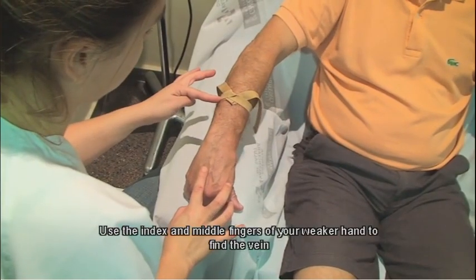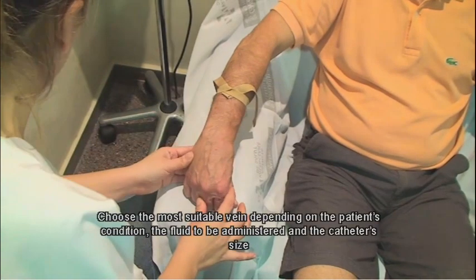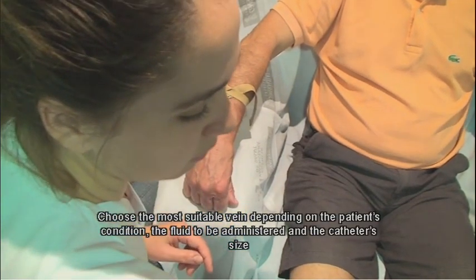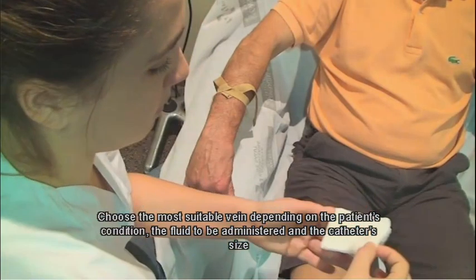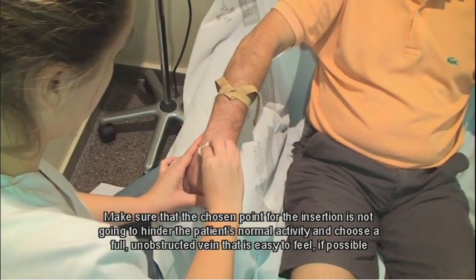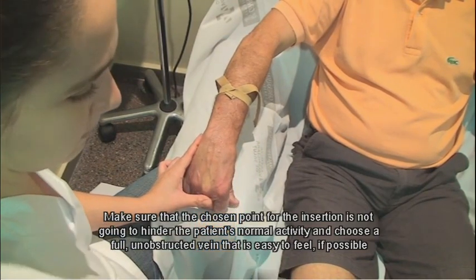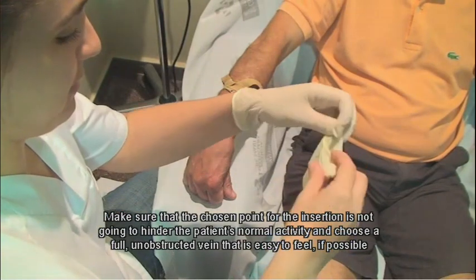Use the index and middle fingers of your weaker hand to find the vein. Choose the most suitable vein depending on the patient's condition, the fluid to be administered, and the catheter's size. Make sure that the chosen point for the insertion is not going to hinder the patient's normal activity, and choose a full, unobstructed vein that is easy to feel, if possible.